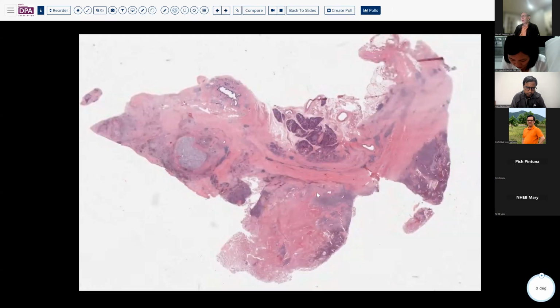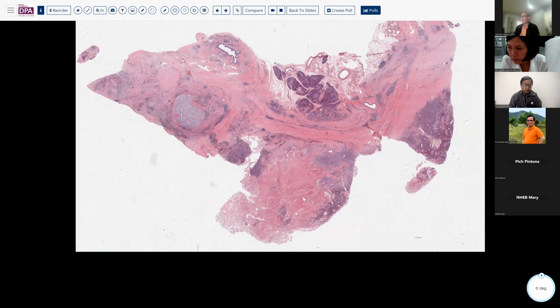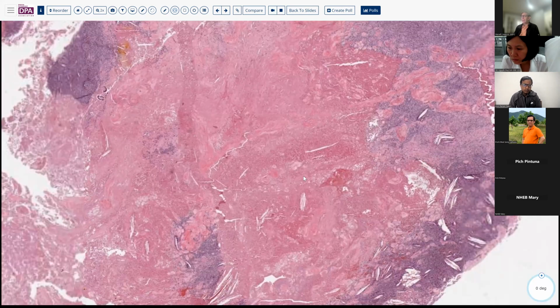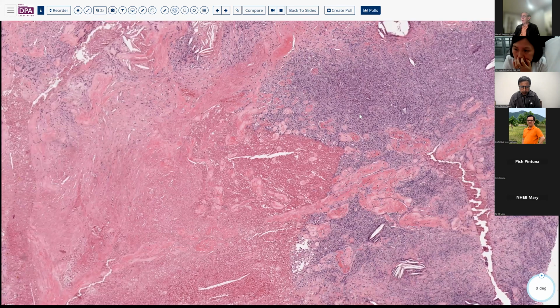Here's one where the tumor is almost completely degenerate. And we look at this and we might even wonder if this is really what it is. You see all these cholesterol clefts. Here's an area of extensive hemorrhagic necrosis. And it's really almost just the ghost-like architecture here of these hyaline cores with a bit of cellularity around them that sort of suggests that this was a solid pseudopapillary tumor.